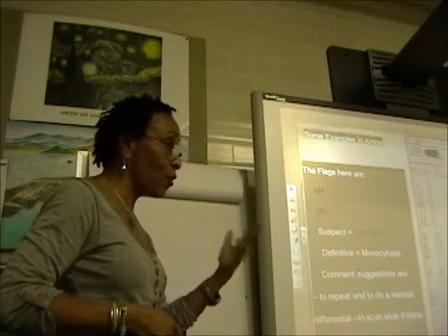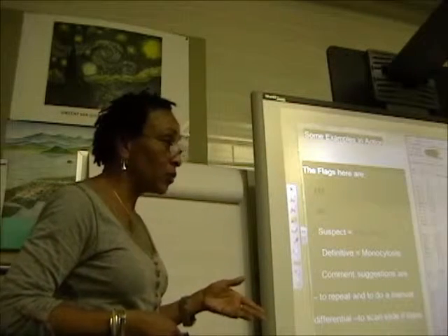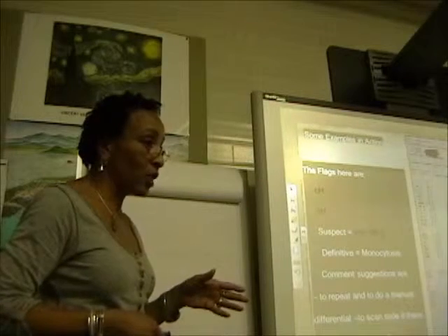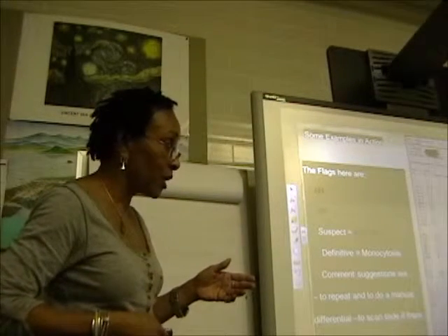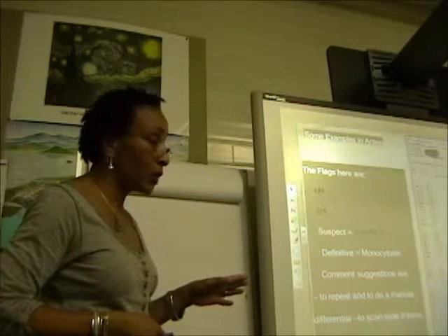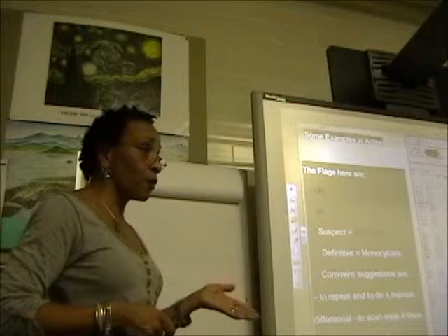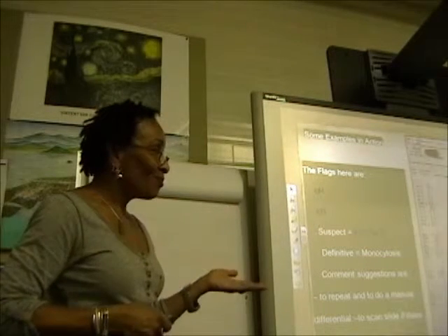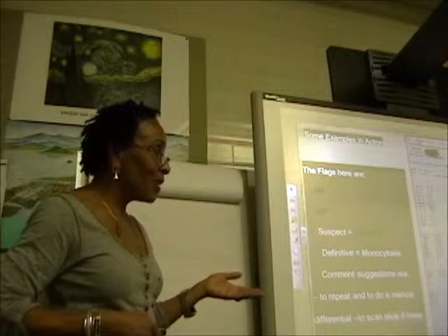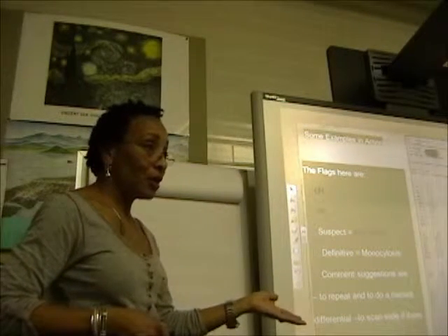But this person, I work at the stat lab for the emergency department, and our clientele is really variable. So it's rare when you can go back through the patient history and find anything on the patient. So if this was a first-time patient, this particular one was a first-time patient, they didn't have any results on them. And down here in the comments it said too, if it's for first time, do a scan. Okay, but I knew it was critical WBC, and so had to go to the slide to make sure.